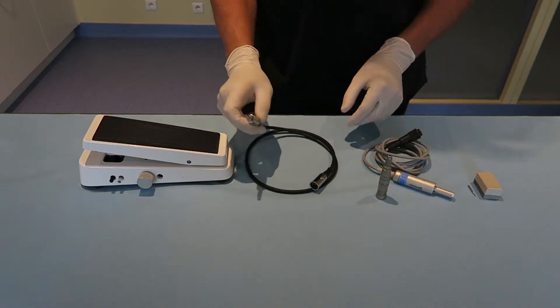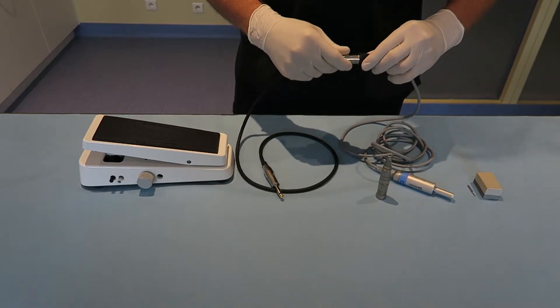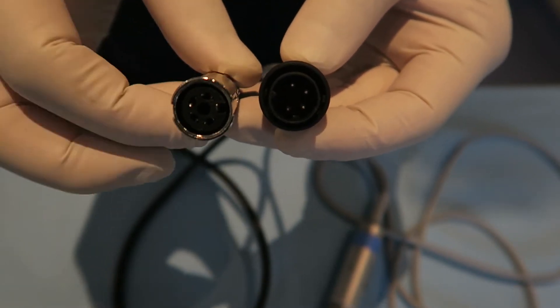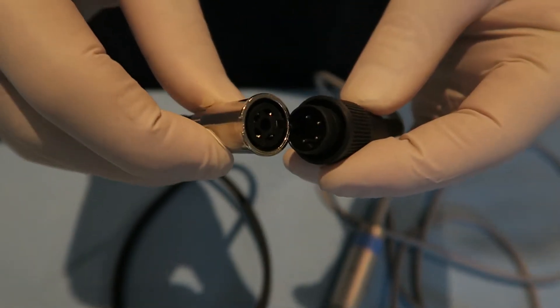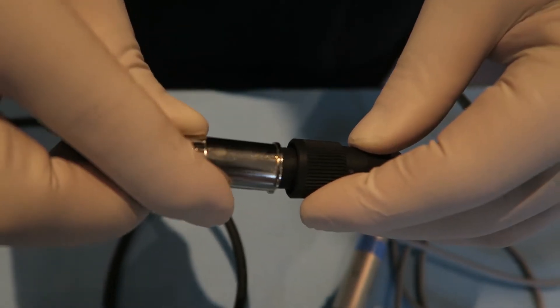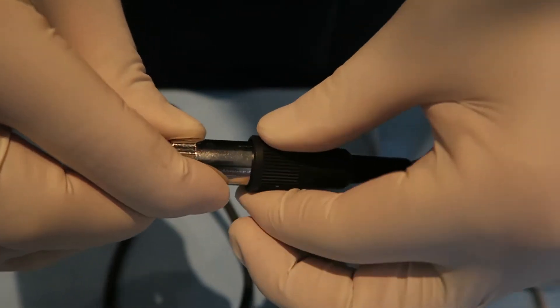To connect the motor cord and the liaison cord, you will first need to find the small notch of the hollow end of the liaison cord. The motor cord only fits in one way. Then you will need to rotate the end of the motor cord and plug it in. Once it is done, you can block it so that it cannot be removed.